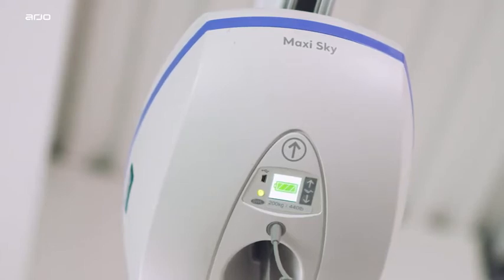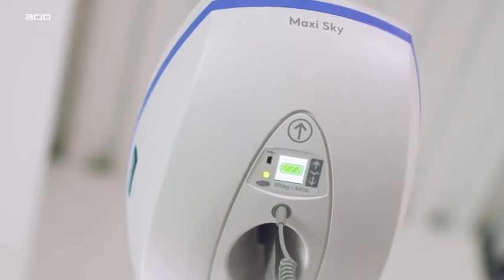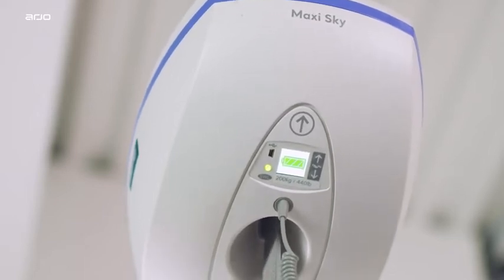Additional features. The lift turns the display off to save energy whenever it's not being used for more than the configured time. Therefore, the Maxi Sky 2 must not be powered off after every use. The LED remains solid green to indicate that the battery's charge is above 25%, or flashing green if the lift is charging. The status LED turns to red when the battery's charge drops below 25% of its full charge.